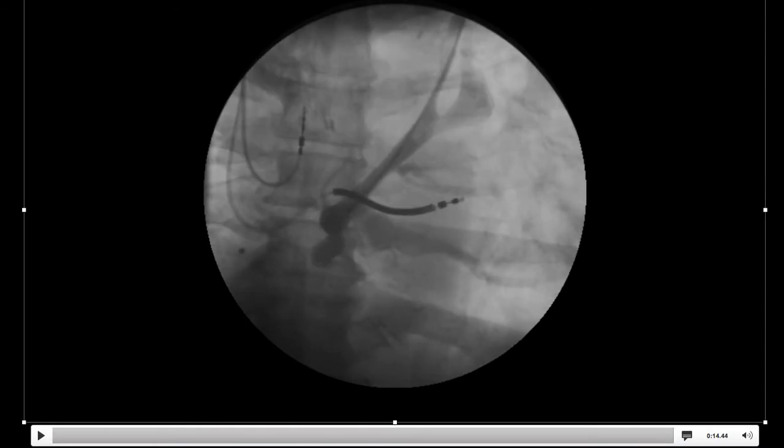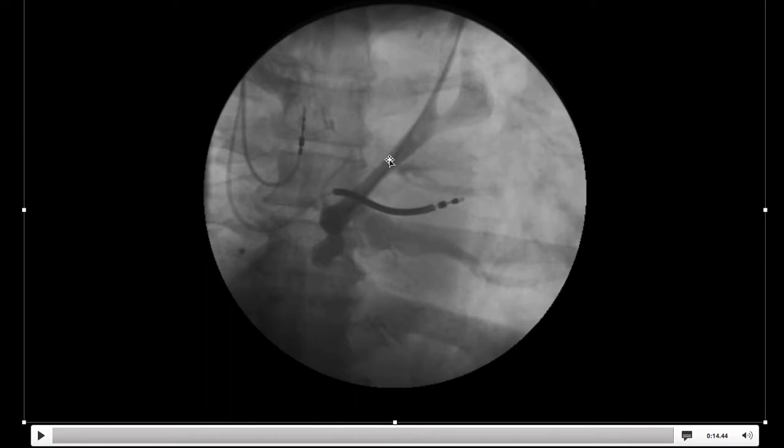You'll note that there's complete CS atresia and no blood return into the right atrium, and importantly, also not into the left atrium. We'll talk a little bit more about that later.